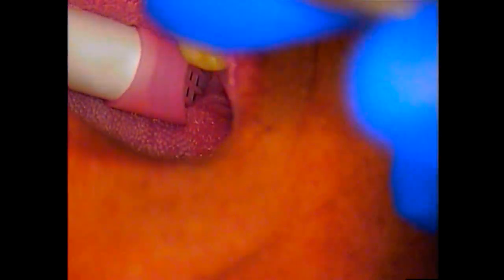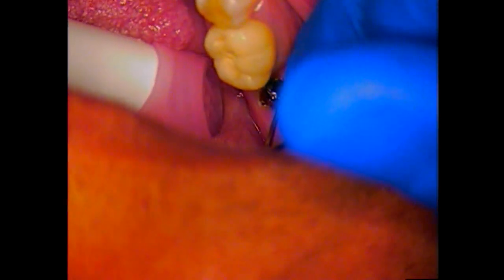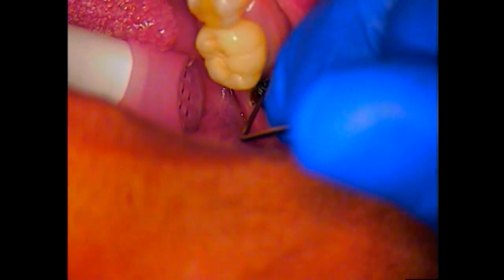We did take a laser and we used it to move the tissue. Now we're going in dry. And we can see there's a space in between the shaft of the screw itself and that of the abutment.